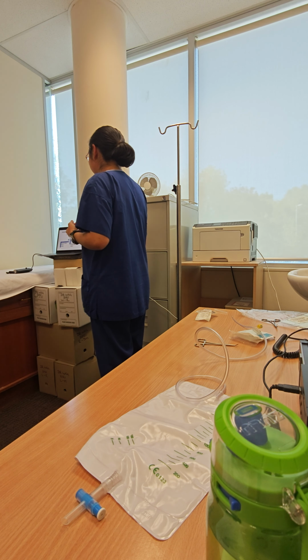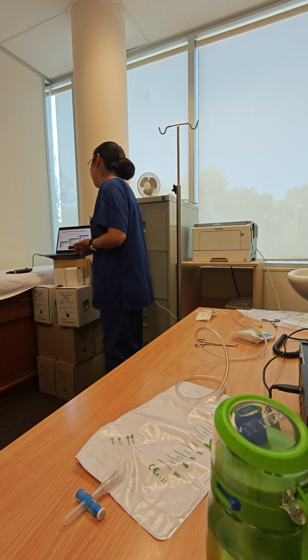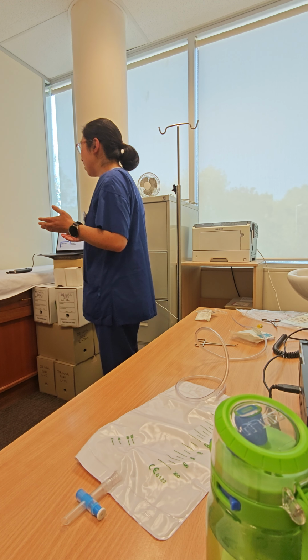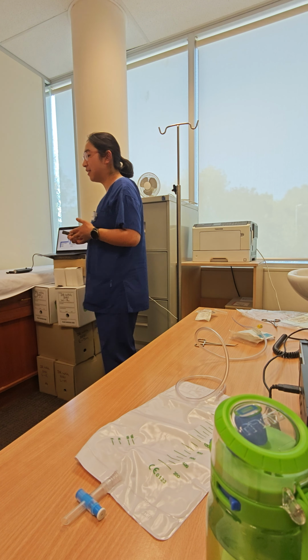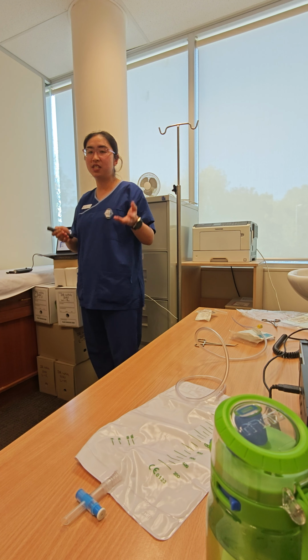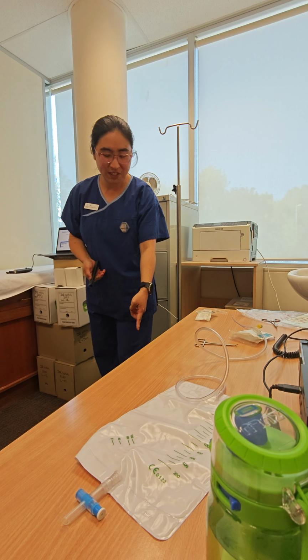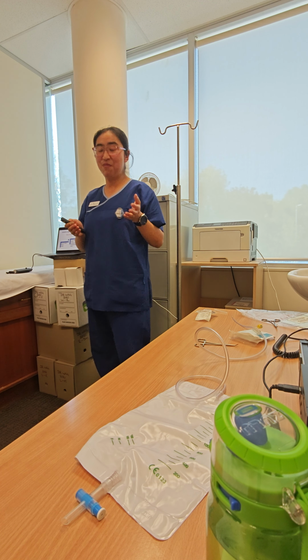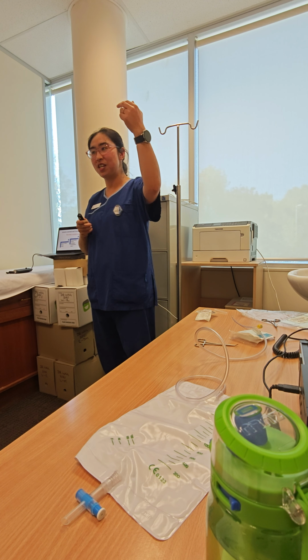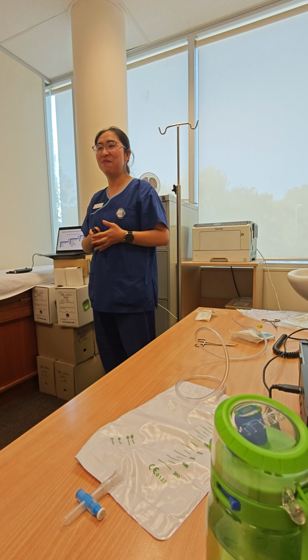Good. So what I learned from these cystograms, or what makes a successful cystogram, it seems simple. But I think to reach a successful one, we need to focus on more details. Like the needles, I've done maybe two or three times. The first time I put the needle in, the contrast never came out straight away.